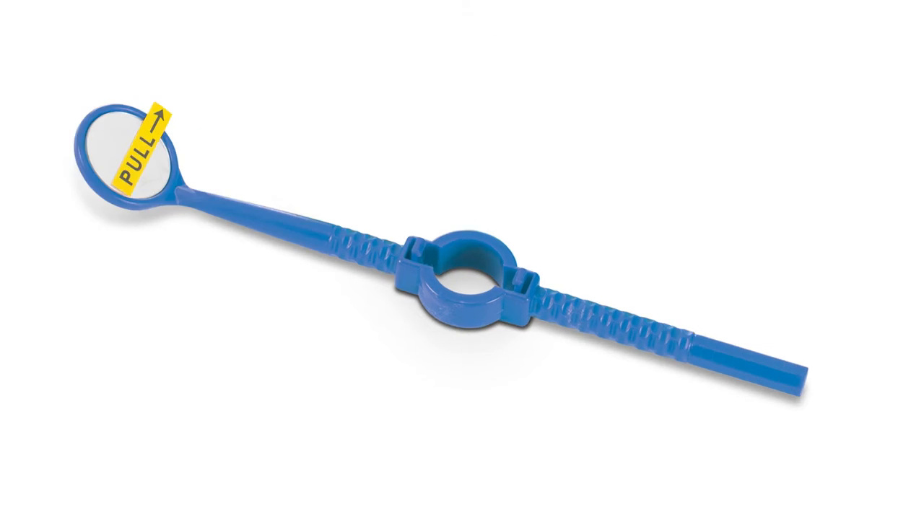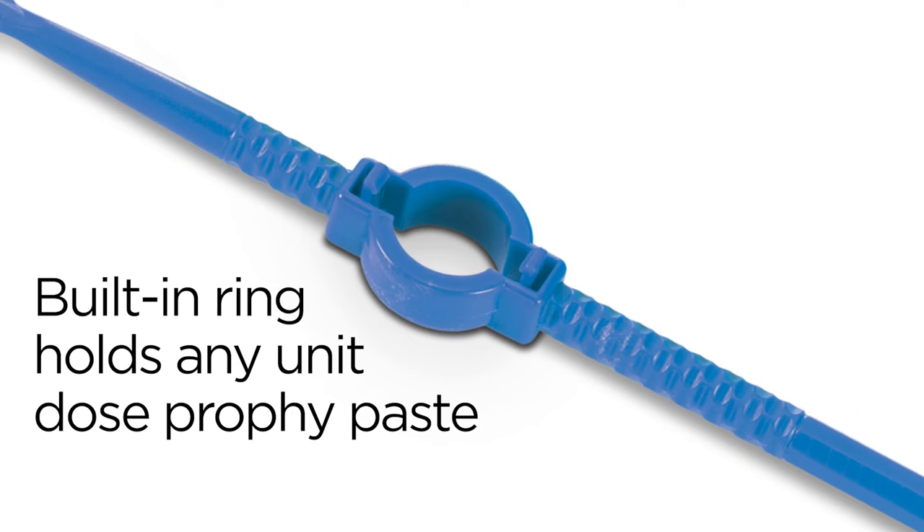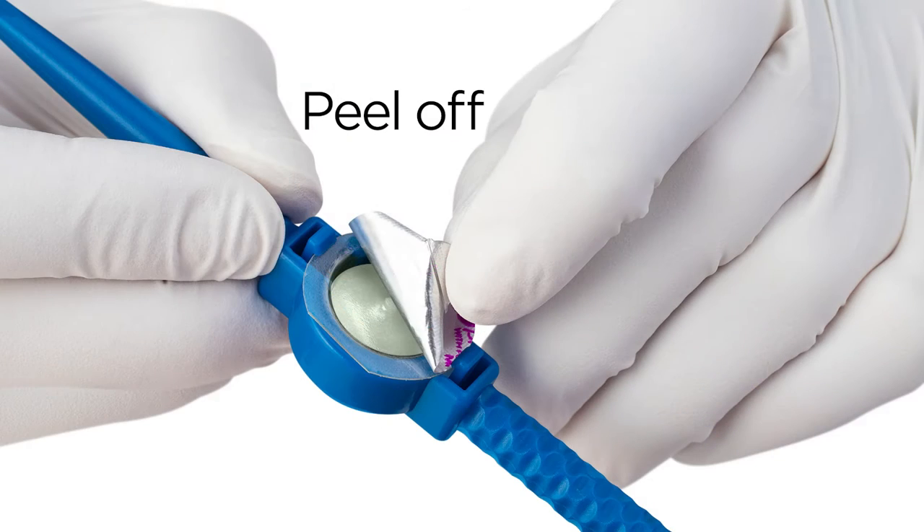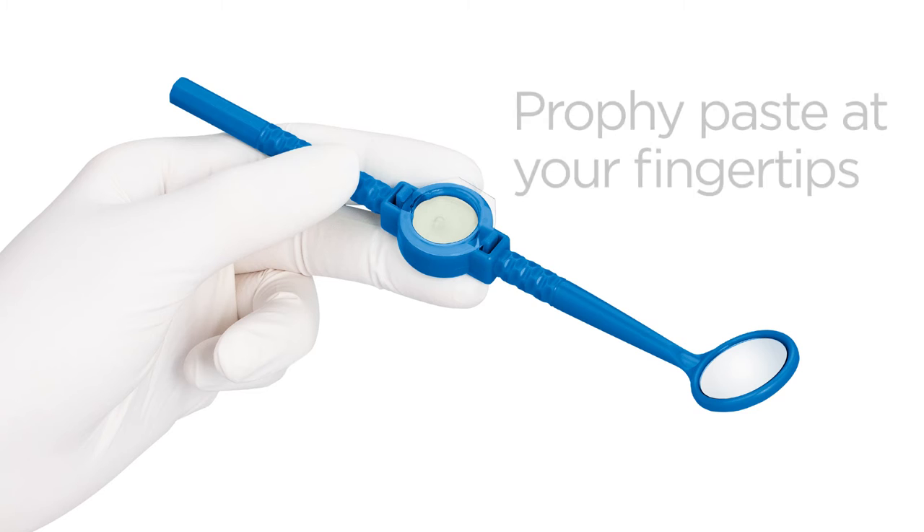The lightweight Versagrip features a built-in ring designed to grip any unit dose cup of profi paste. Simply snap in your favorite paste and peel off the cover. Versagrip will hold it close and convenient for the entire polishing procedure.